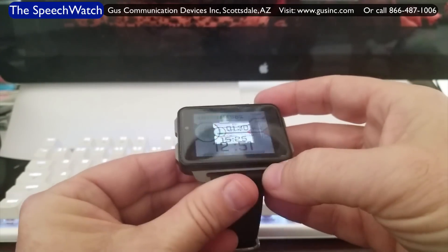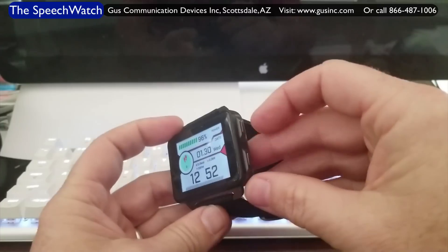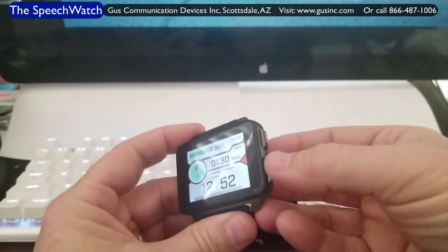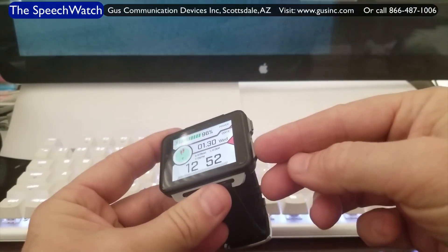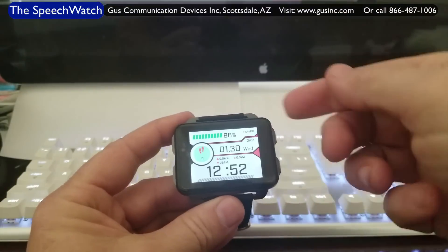Coming over to the right side of the watch, this button is your back button — it's like going back to the previous page or screen. This is your home button, like on an iPad or an Android tablet, where the button at the bottom takes you back to your home screen.